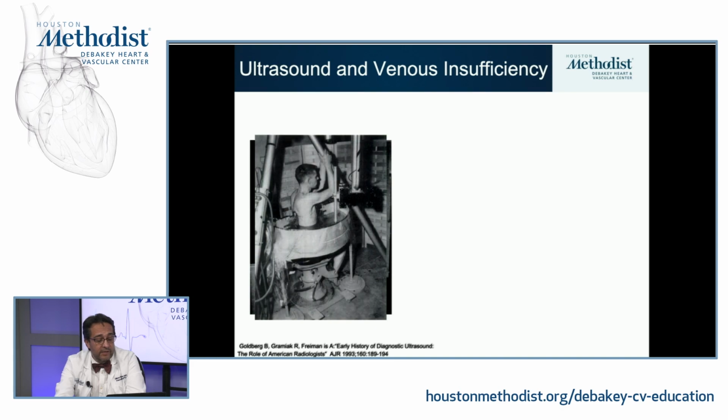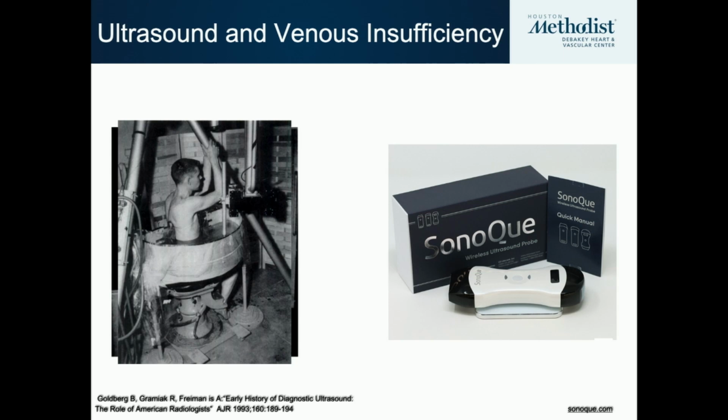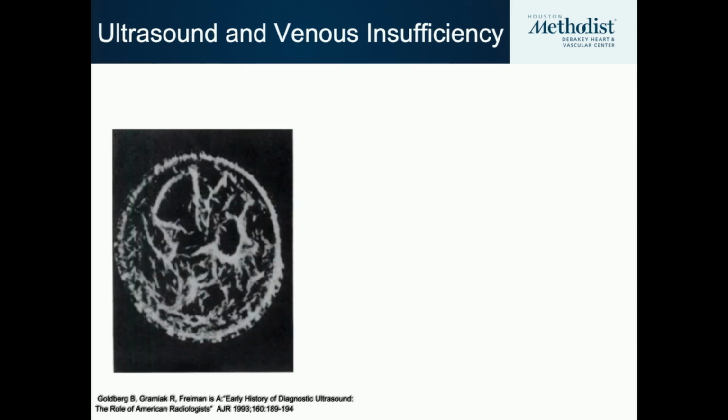decent image, right? Now, all this has evolved, and again, we are not endorsing any products in this program. This is what is on the internet, and I don't know if it's projecting on your computers or not, but at the end I put all the references. We are not endorsing anybody. But the ultrasounds that we have today are just a single-piece handheld device that connects to your cell phone. So the technology has evolved immensely, and has also improved the picture that we obtain, like this leg back in the early days.